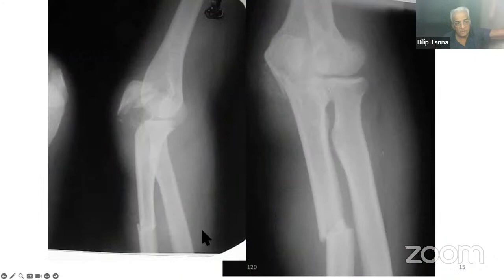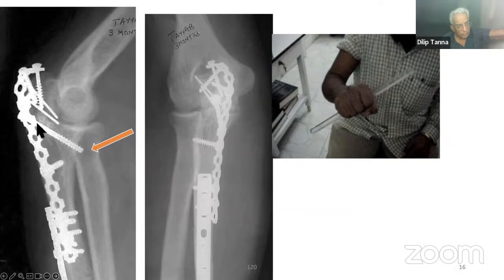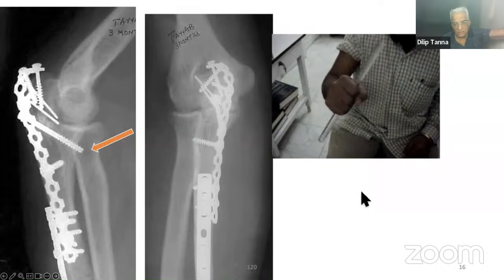Now here is the fracture. As you can see, this is the olecranon fracture and also the upper end of the ulna. This was treated with an ordinary recon plate and screws, but this is the most important screw. There was a separate plate for this. At 3 months, you can see an excellent range of movement, and he can do flexion, extension, supination, pronation perfectly.